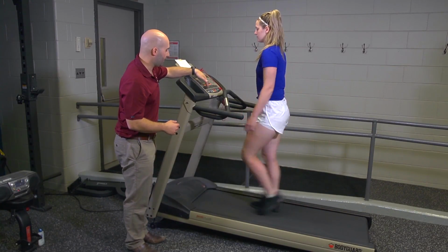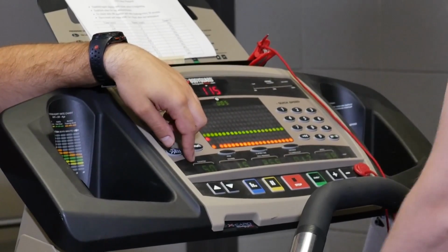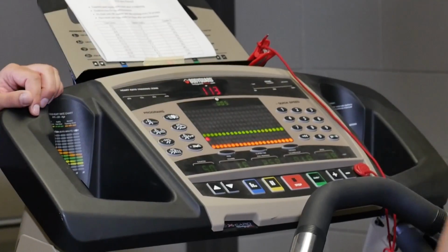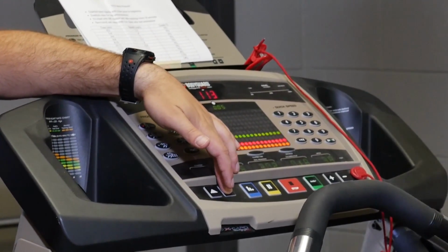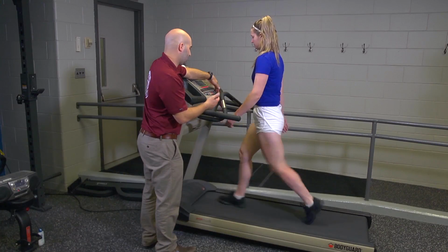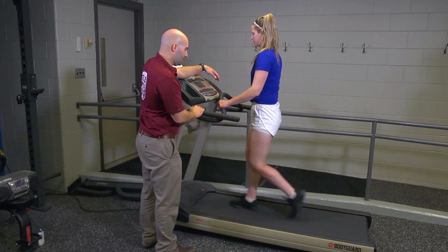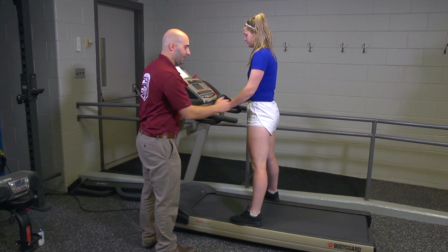So when you look at your elevation, and remember it should say 5.0, not 0.5, because that's only a 0.5% slope. We're looking for 5% slope. Let's assume the test is done. I'll immediately decrease the slope to 0 and then decrease the speed. And I'll instruct her that when she's ready to grab onto the handlebars, and then with one leg step on a rail and then the other one, and then she'd be fine.